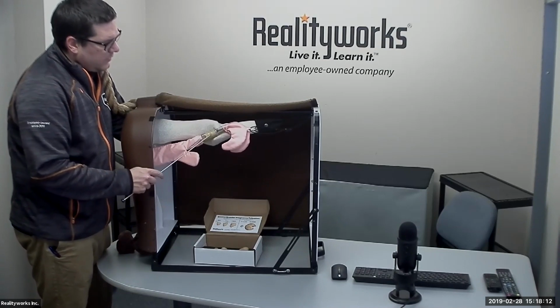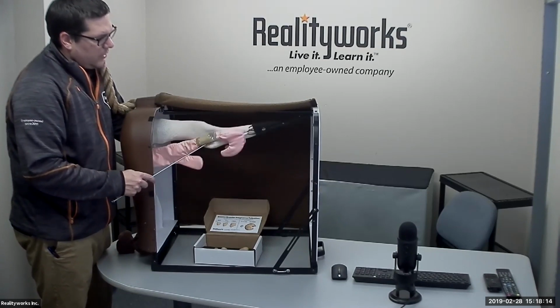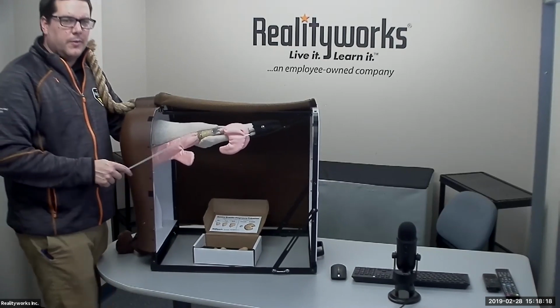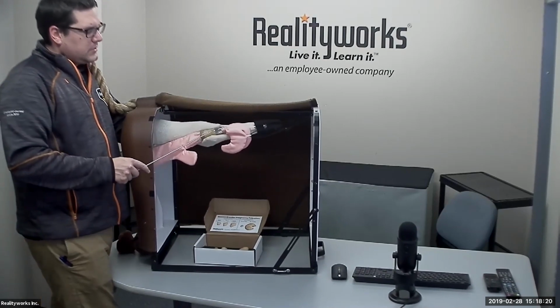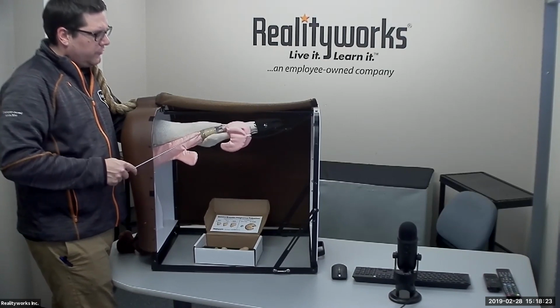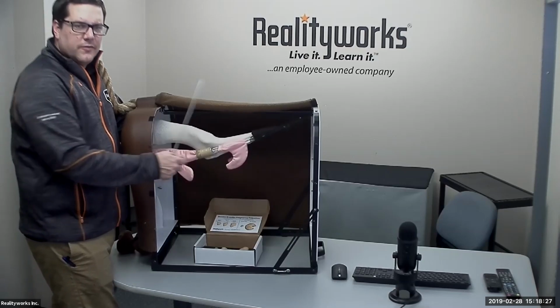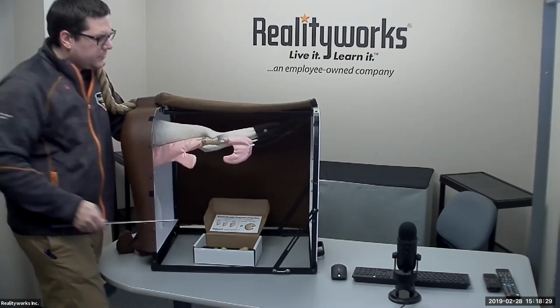And then we have the cervix here, where in our model it is clear. This allows you, from a teaching point, to teach how the cervix has 3 rings, and you have to go through the folds and then get into your landing area here, which is at the very end, to be able to see.